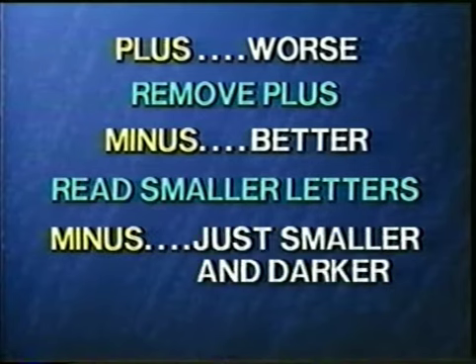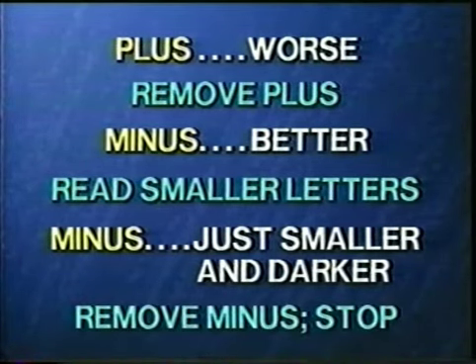The next change in the minus direction made the letters just smaller and darker, as happens when the patient begins to accommodate. This last change in the minus direction was therefore removed, and adjustment of the sphere was complete. Let's watch this last sequence from the patient's view.